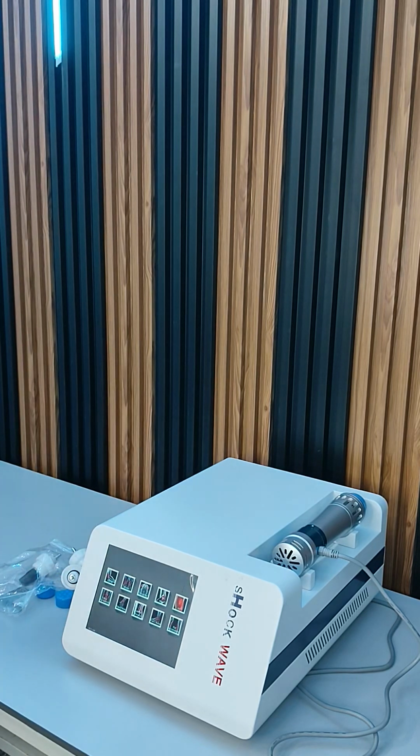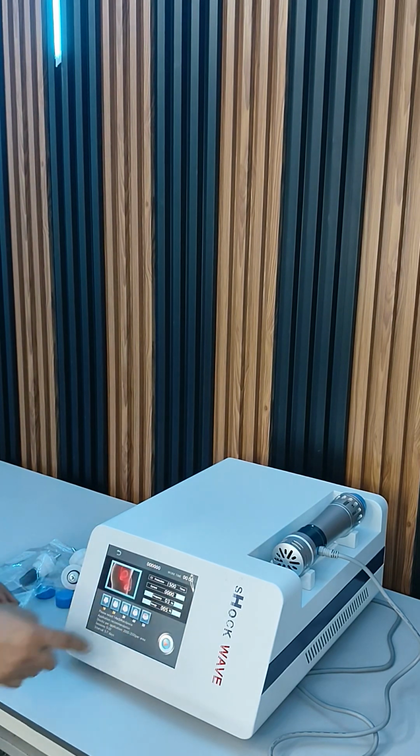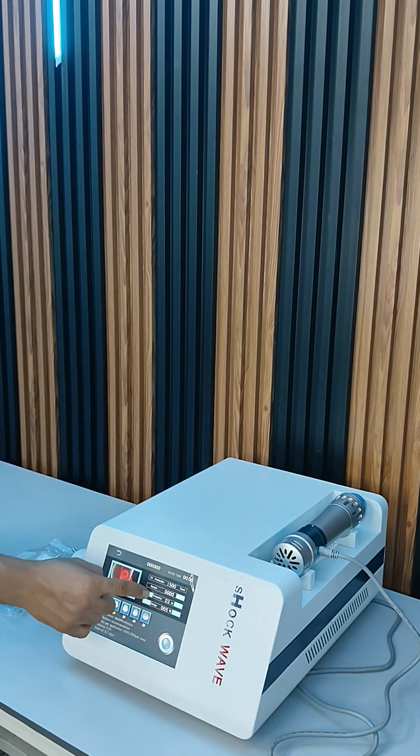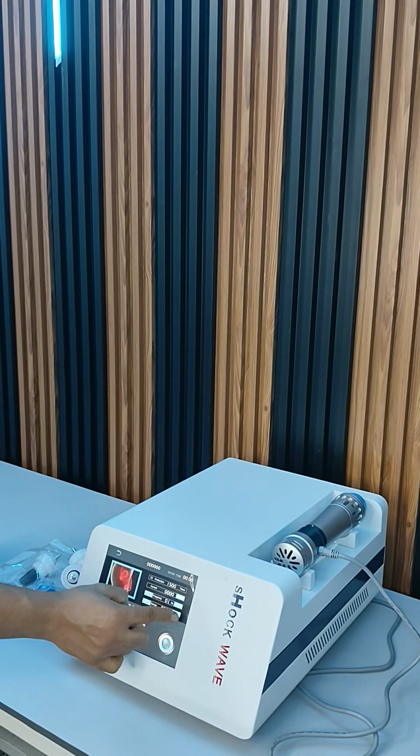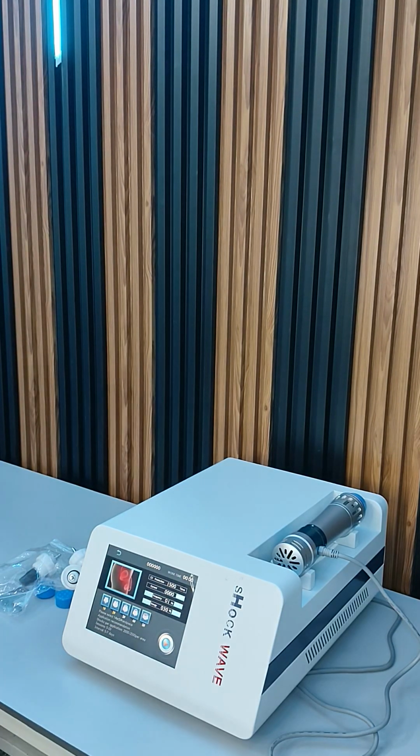You can select the other programs also, like the ED. If the frequency is 1, you can go up to energy 25, 30 millijoule, which is quite enough for the ED. I will show you the demo of how effective 30 millijoule or 5 millijoule and 200 millijoule is.